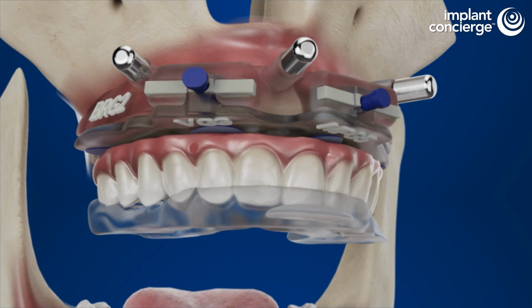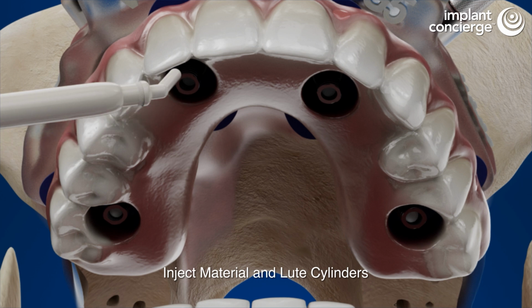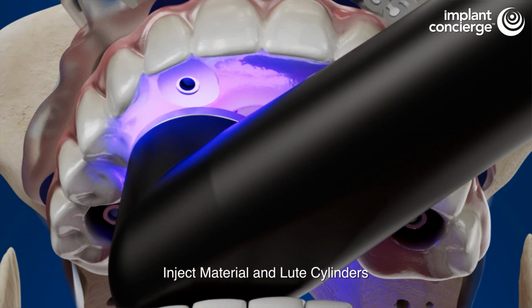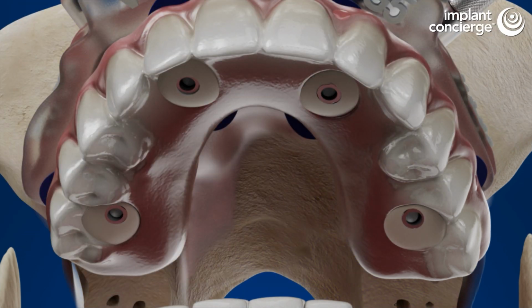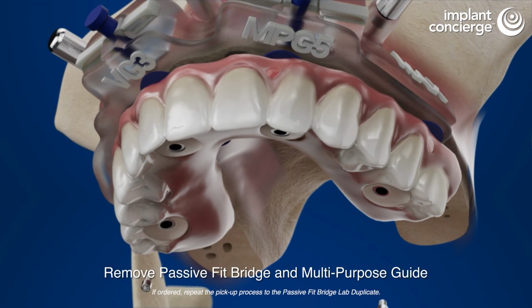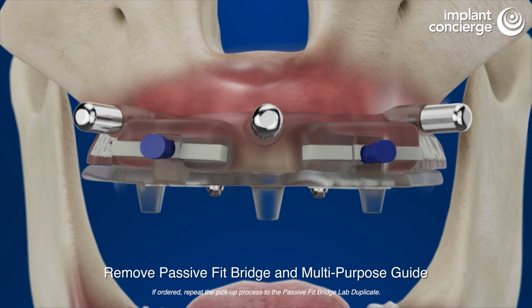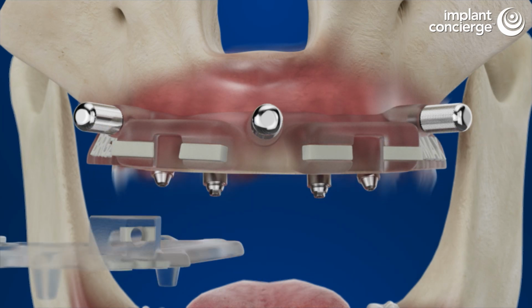Follow the material manufacturer's curing recommendations. Inject the material through the occlusal surface. Follow the material manufacturer's curing recommendations. Remove prosthetic screws and the passive fit bridge, ensuring the temporary cylinders are securely attached. Remove the blue pins and the multi-purpose guide.